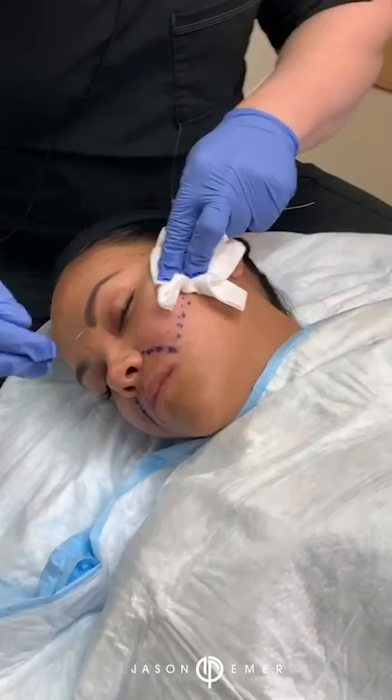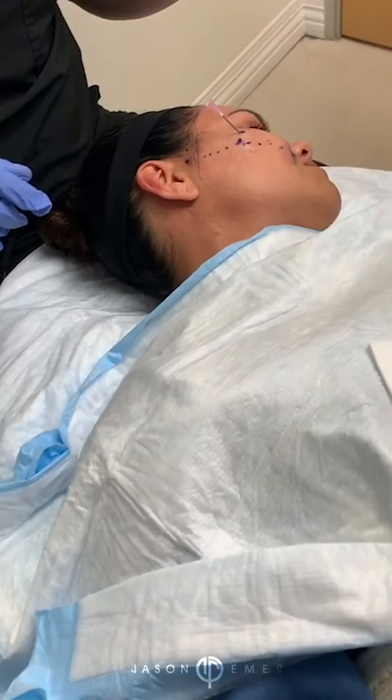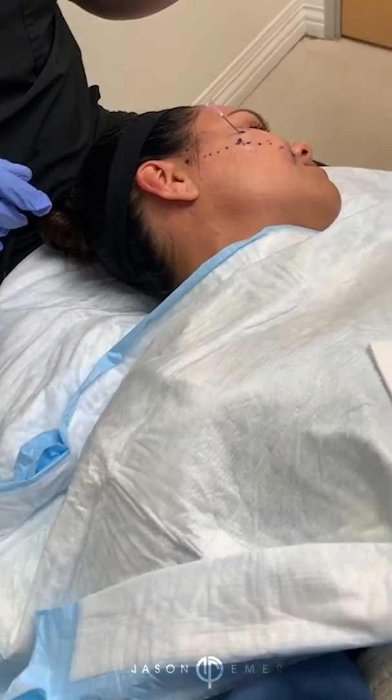Now we're going to rotate to the other side and I'll show you guys it when we tighten the skin. That was so quick — we're going to go to the other side now. I do this a lot, by the way. We were laughing about that — when we first started this years ago, the rep said it should take like an hour to an hour and a half. I'm like, what? I'm like, to who? That's crazy. When John said he was thinking about 20 minutes, I'm like, wow.